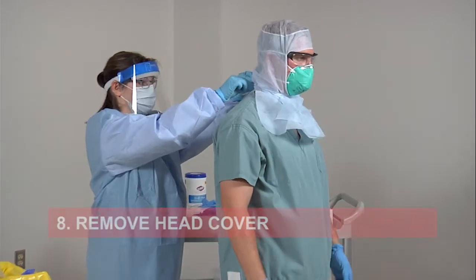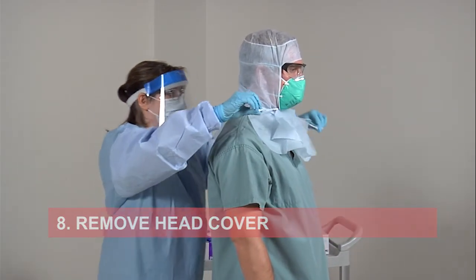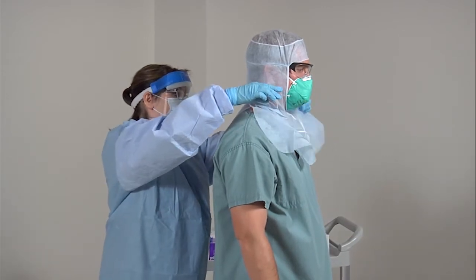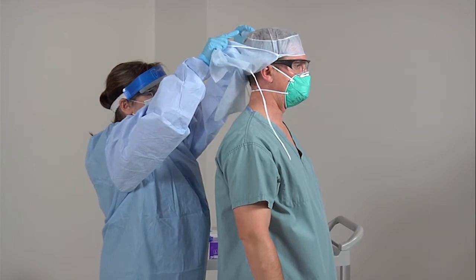The quality monitor will untie your head cover. They will pull the sides back from your face and pull the head cover off from the top of your head. The quality monitor will discard your head cover.